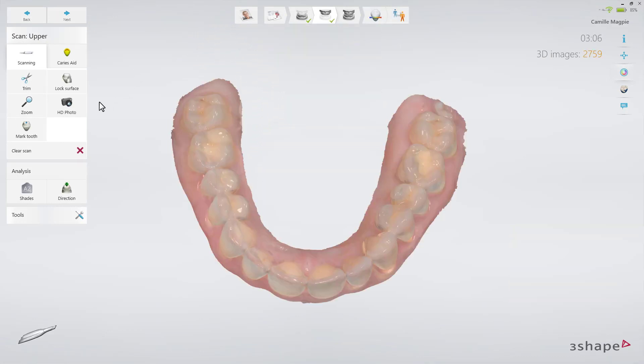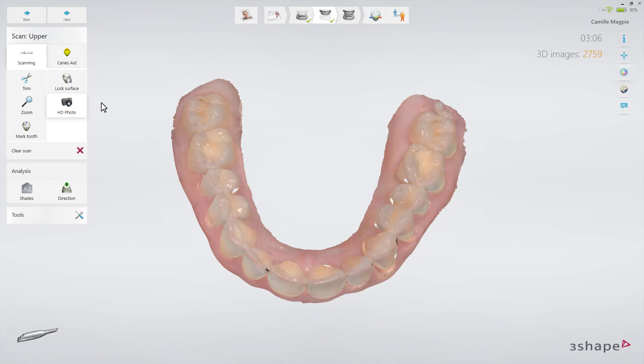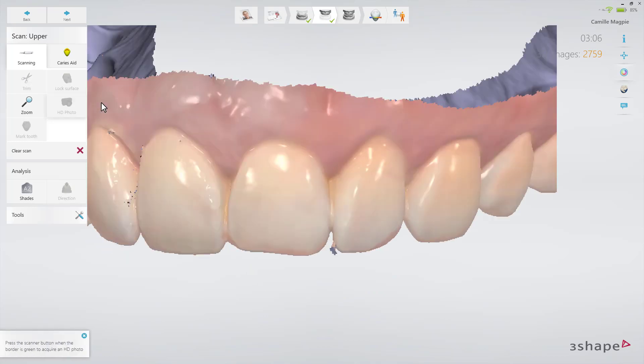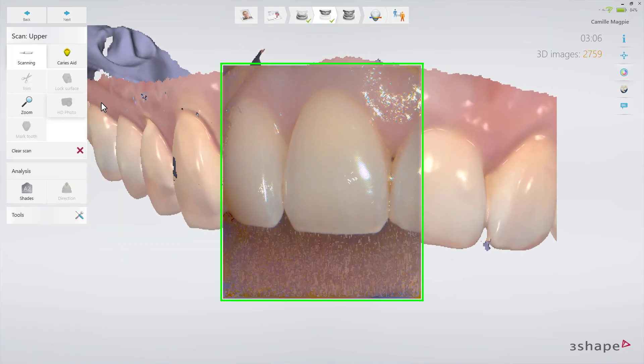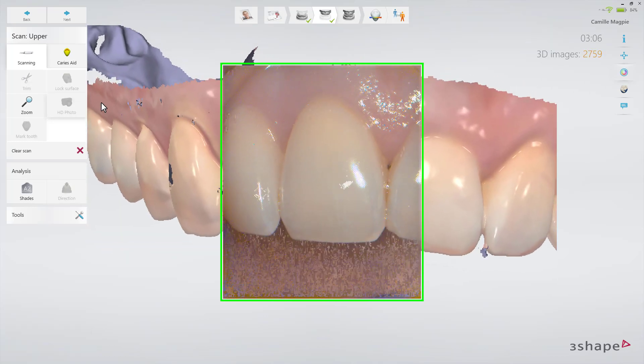Activate the HD Photo option by clicking the corresponding button from the menu on the screen, and then select the area of the scan drawer where you wish to apply it. Start the scanner.